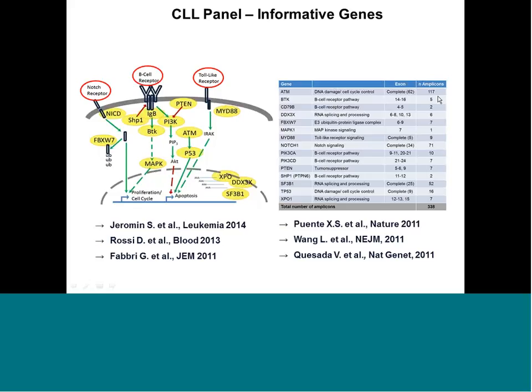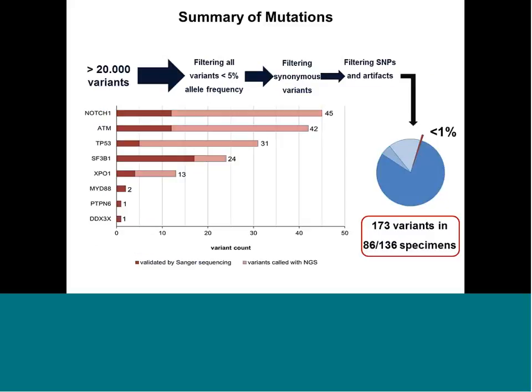And some exons are so large that you need multiple PCRs from FFPE material. So there was no chance to do this by multiplex PCRs. And so in this case, we applied an enrichment technology where we enrich all informative genomic areas and then sequence them. And thereby we generate a massive number of sequences.